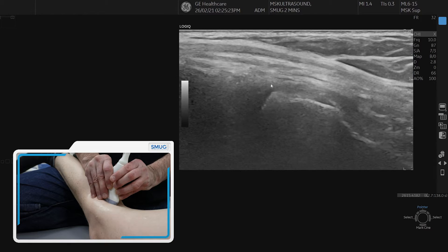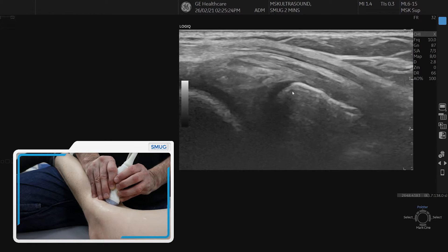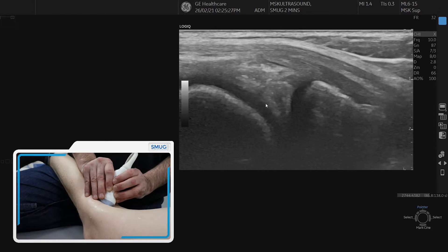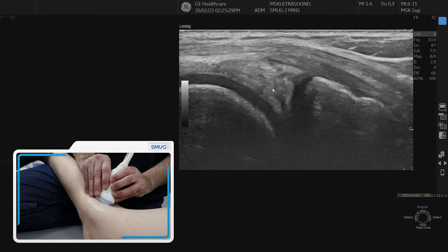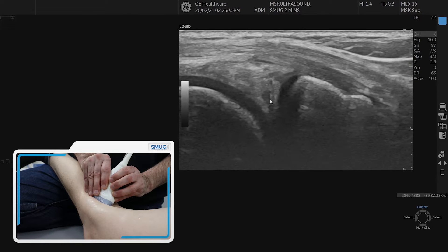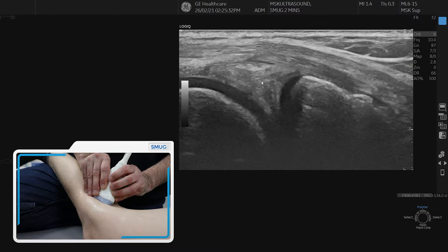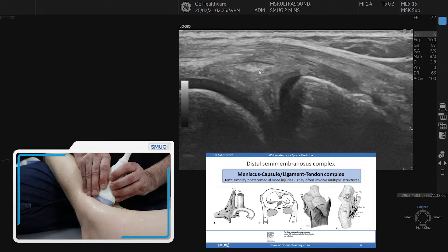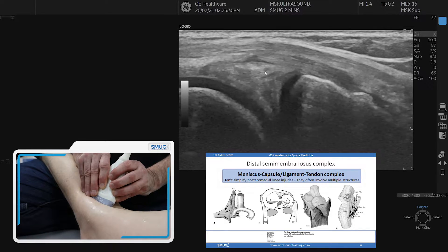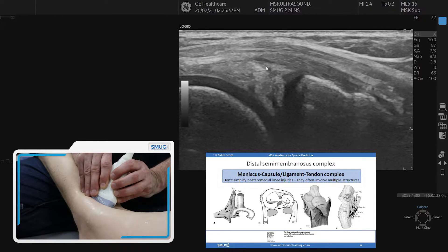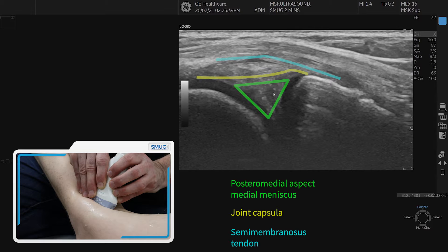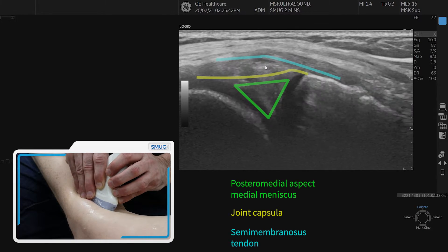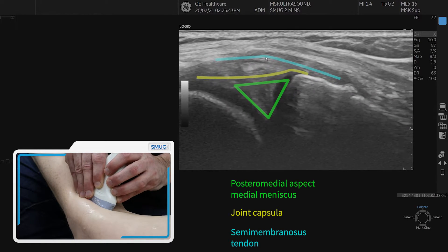Now we're going to go back and optimize for the posteromedial joint. We move the probe a little bit more posteriorly and optimize it for the posteromedial meniscus — the peripheral margin of the posteromedial meniscus. A nice picture here shows the posteromedial meniscus and how it is stuck to the capsule on top.